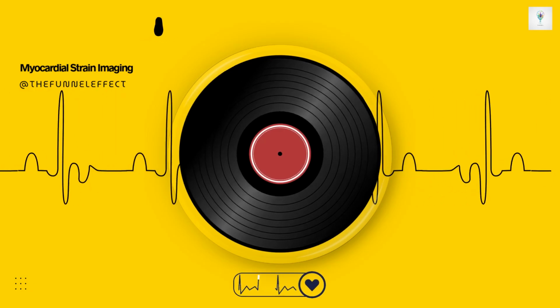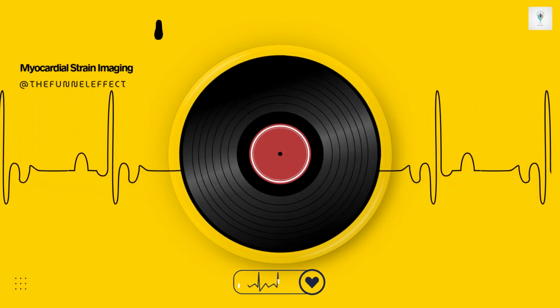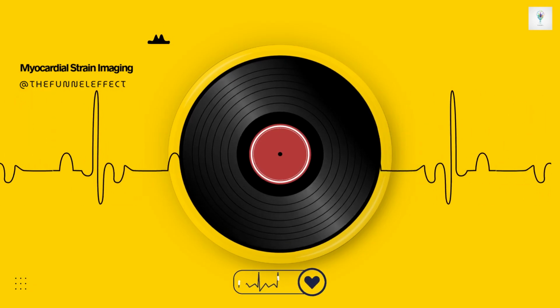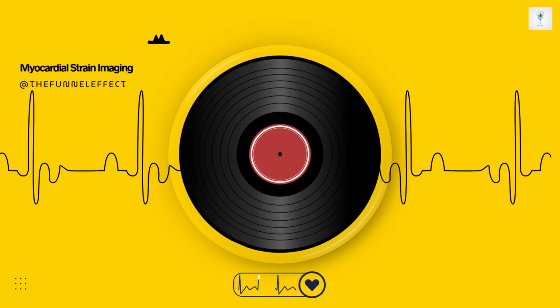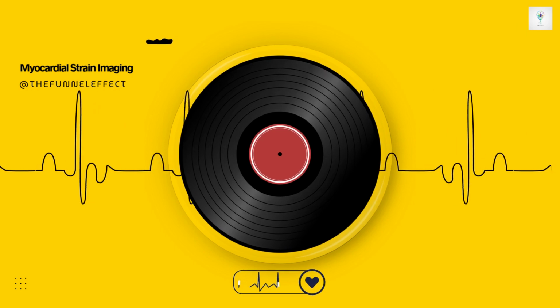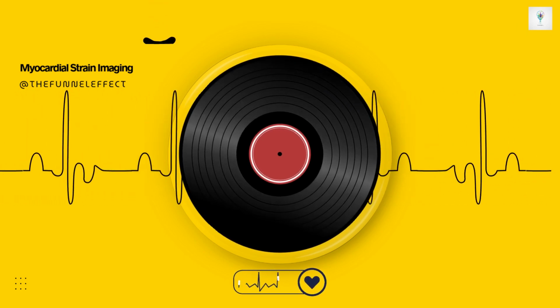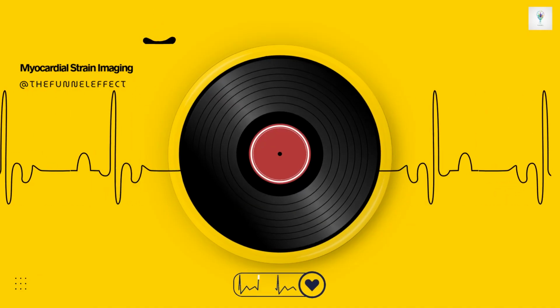Exactly, which reduces the pump strain value. It's also obviously confounded if the patient has intrinsic atrial muscle disease or atrial myopathy, or if they're in atrial fibrillation where the pump function is completely absent. So while useful, reservoir strain is generally seen as the more stable and reliable parameter for assessing filling pressures.